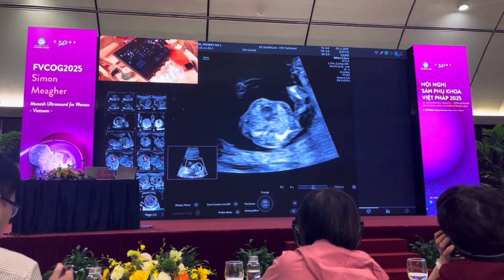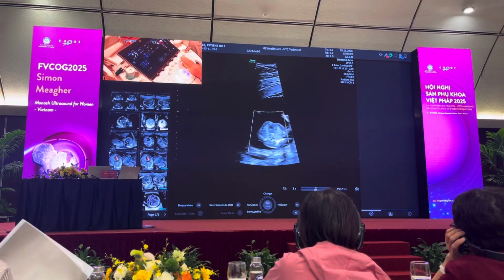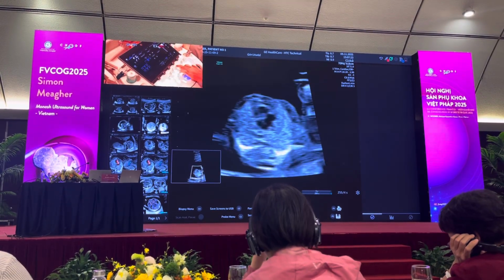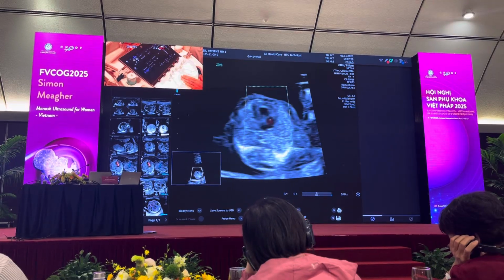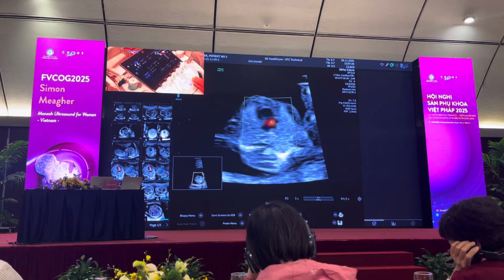So I just want to take some more images of the four chamber view of heart. So I'm going to just HD do that once more. And I just want to go through the cardiac settings. So first of all, you can look at the color. When you look at color, your PRF needs to be somewhere between 25 to 35 centimeters per second.